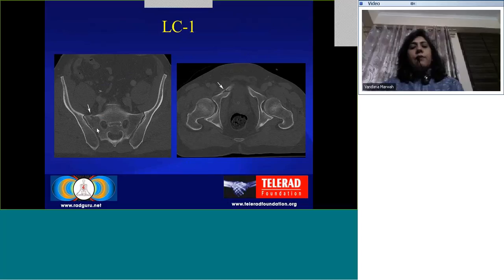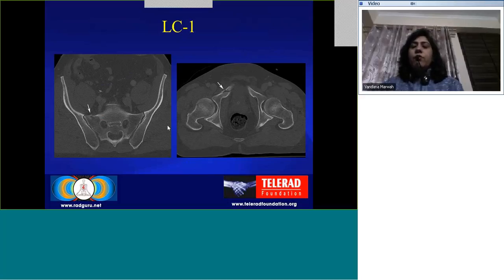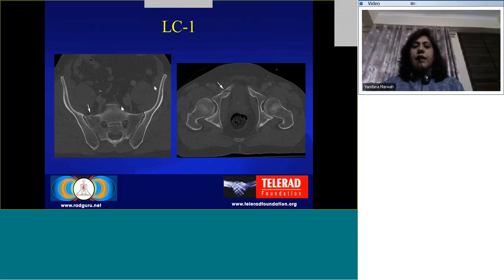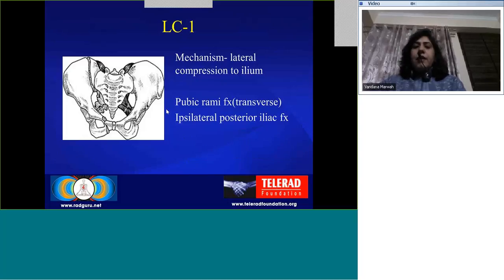If you know the patterns, you know exactly where and what to look for. You may not always want to formally classify it as LC1 or LC2, but you definitely want to enlist all the fractures. These classifications are helpful because you know exactly what patterns to look for. In LC2, there is a fracture of the pubic ramus on one side, and instead of the sacrum, the posterior fracture is in the iliac bone — the mechanism being lateral compression to the ilium.